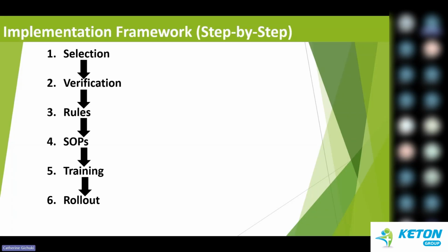Then you roll out implementation across sites. You don't want to introduce it all at once. If you have two platforms, you do it on one, monitor how it's performing, and after you monitor how it's performing on this platform, maybe introduce it to the next one, or even go profile-wise. So this is about turning third-party QC into a controlled, standardized process.